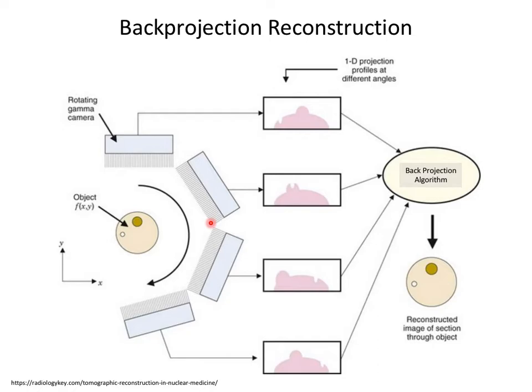When you're doing this data fusion for multiple scans, is it going mostly off of encoders on the gantry that know where your gantry is? Yes. Basically, there are encoders on the gantry, and you program where you want your views and how long you stop at each view.